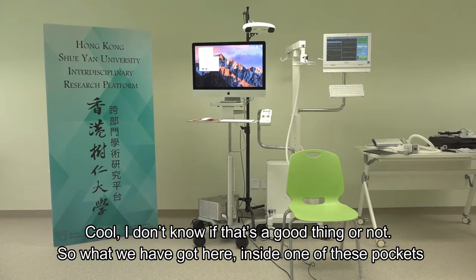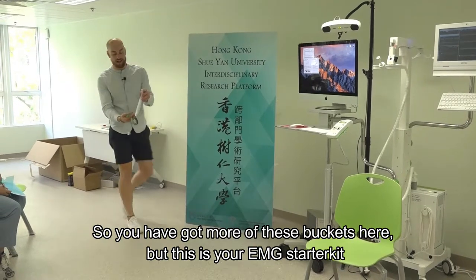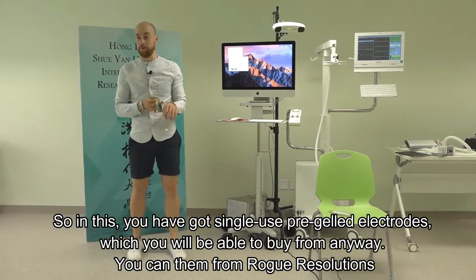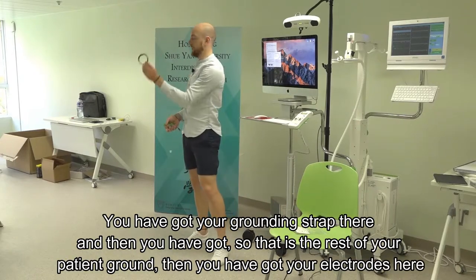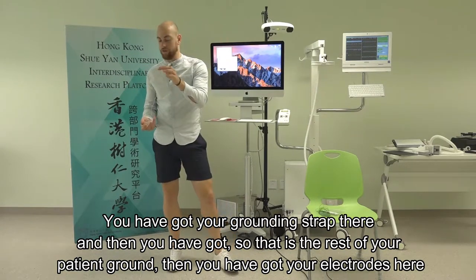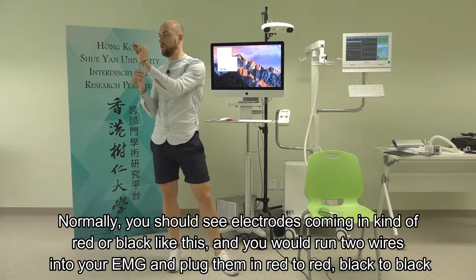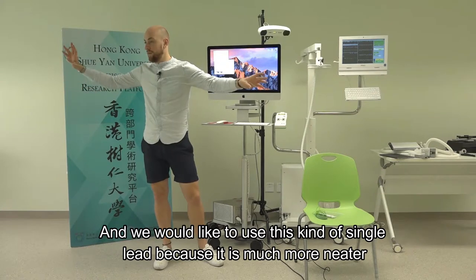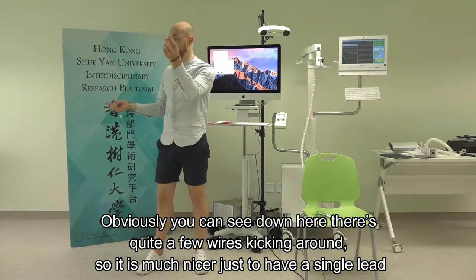Inside the EMG starter kit you've got single-use pre-gelled electrodes, which you can buy from Rogue Resolutions or anywhere online. You've got a grounding strap and your electrodes. Normally electrodes come in red or black, and you'd run two wires into your EMG, plugging red to red, black to black. We prefer to use a single lead because it's much neater given the number of wires already present.